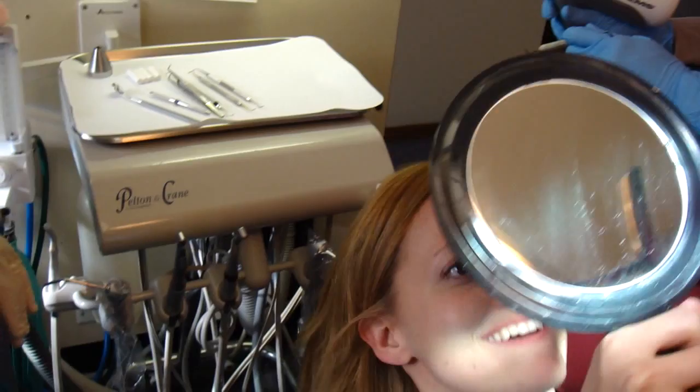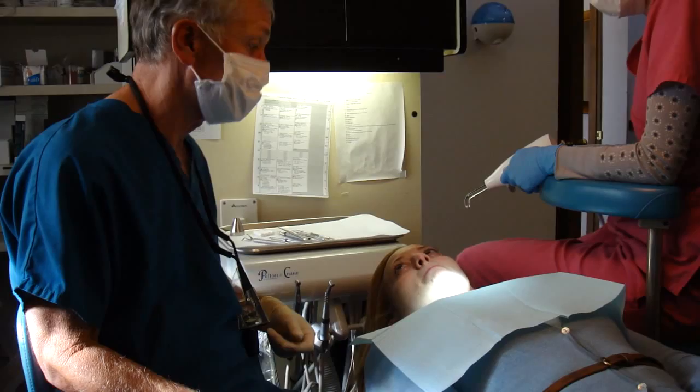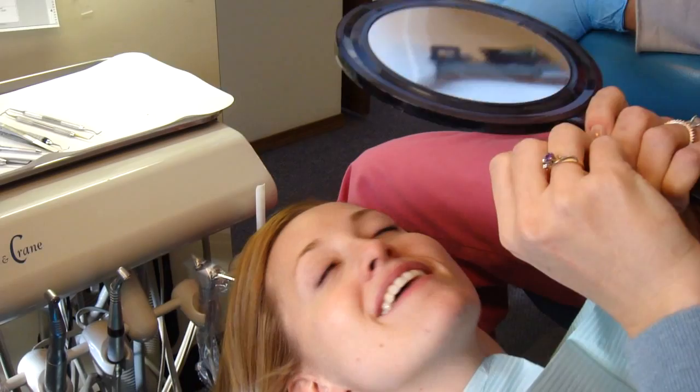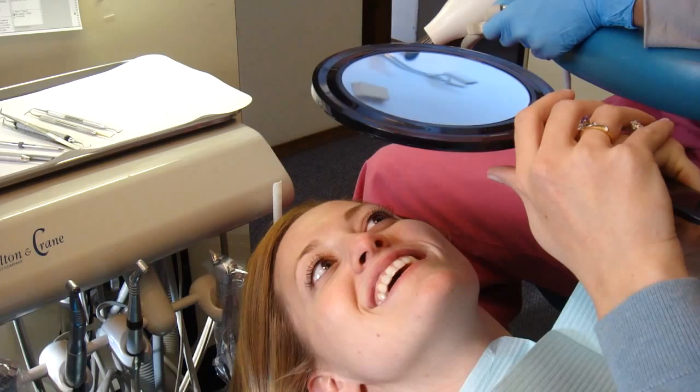And I'm thinking, what would we do? You can take your glasses off. Oh my gosh, I would have a smile. That is so cool. So now I'll lengthen them a little bit, okay? This will be different than the last time you looked — see which you like better. Oh, I like that. Oh my gosh. That looks like they're not little anymore. I like that length a whole lot better. Yeah, I think it is too.